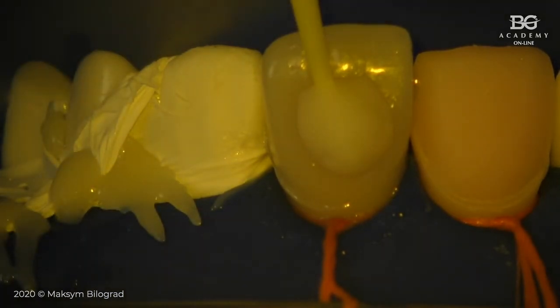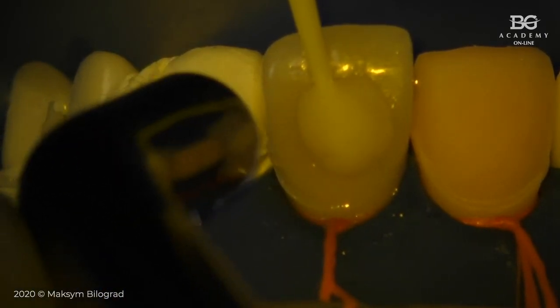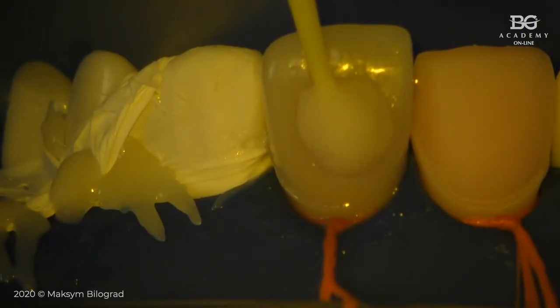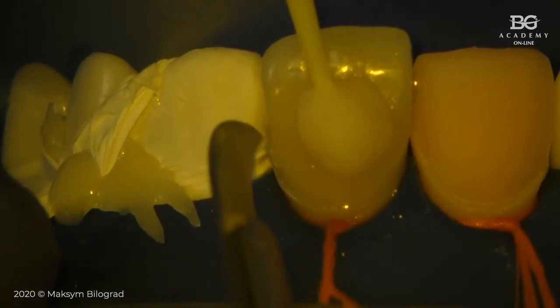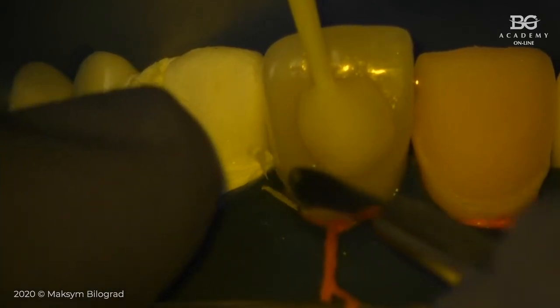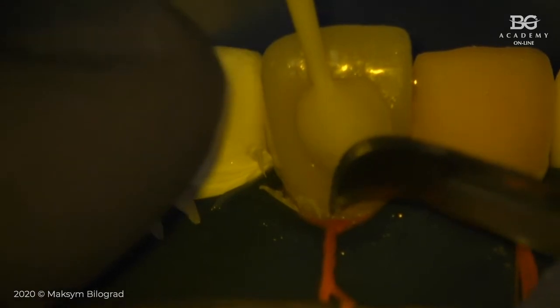Now you can take your fingers out, and if you really want to do this pre-cure, like 1 second, see, from the buccal surface material is not cured yet, so you can just pre-cure, and then you can take your probe, or your scalpel blade, or whatever you want, and you can cut this pre-cured cement easily. See, it's easy to be removed now.